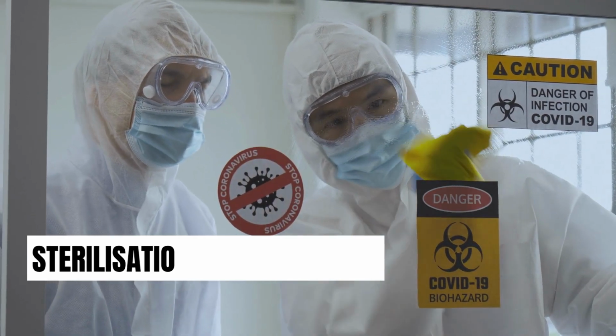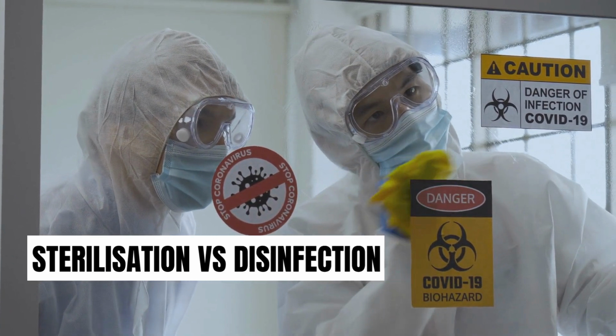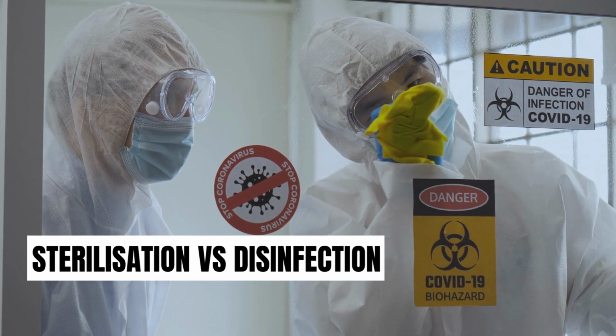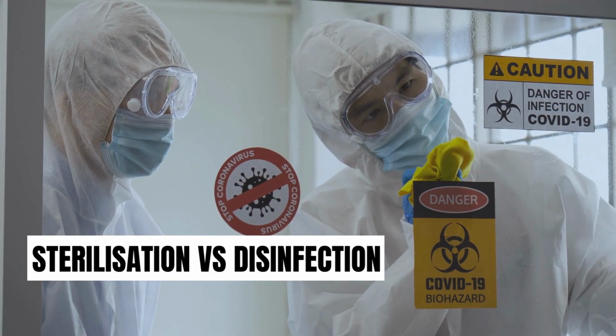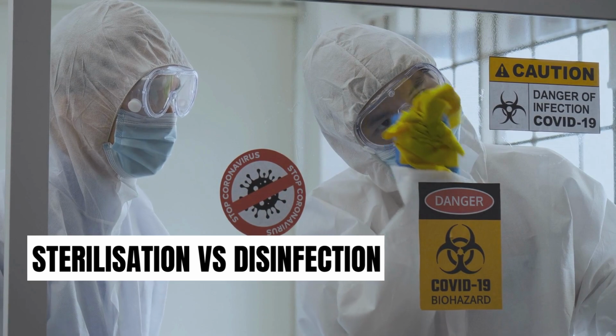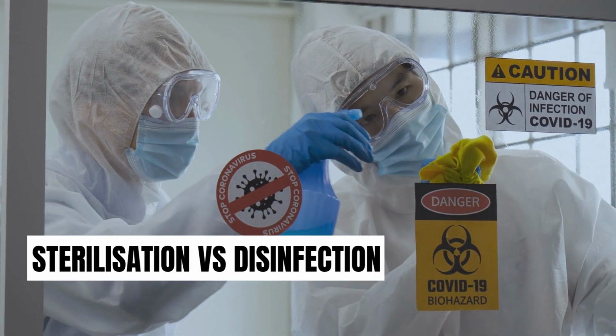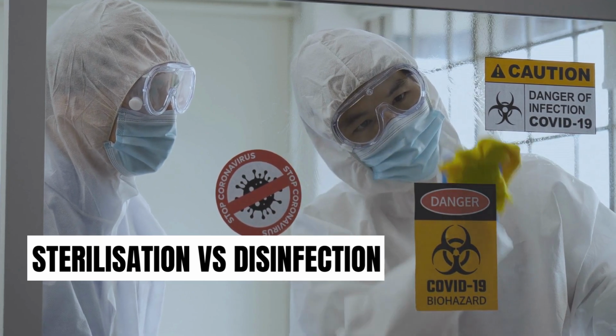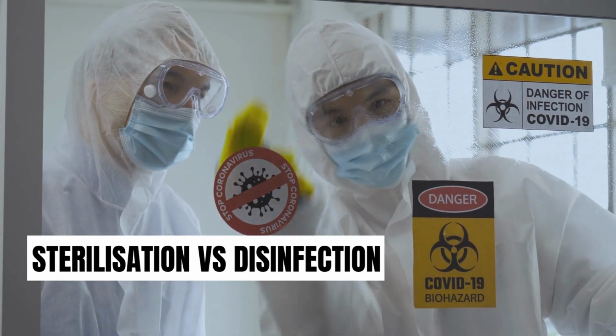There is a distinction between the terms sterilization and disinfection. When we say sterilization, we are referring to the condition in which the destruction of all microbial forms takes place, which includes viruses, but more importantly, the spores of the bacteria.